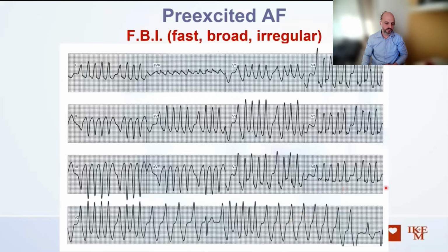And it's important because we should not give any drugs. We should proceed directly to cardioversion, and we should recognize these arrhythmias.